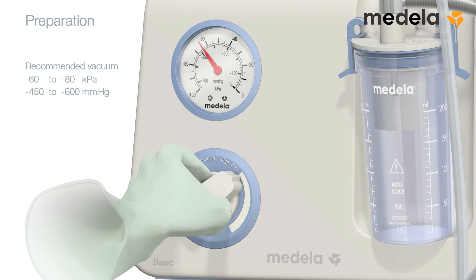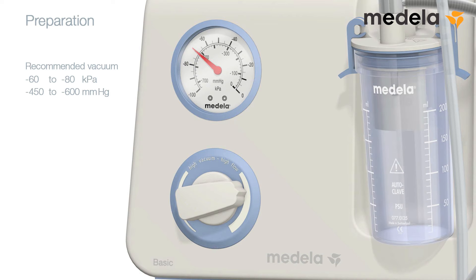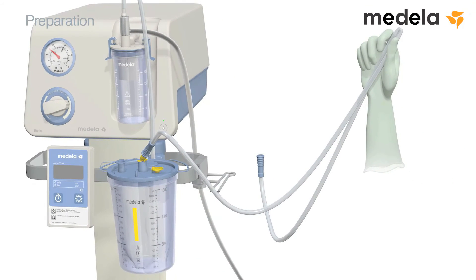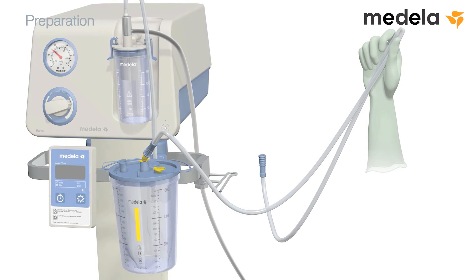The recommended vacuum level is between minus 60 and minus 80 kilopascal. This is equivalent to minus 450 and minus 600 millimetre of mercury. When the vacuum gauge shows that the vacuum is stable at the set level, release the tubing.